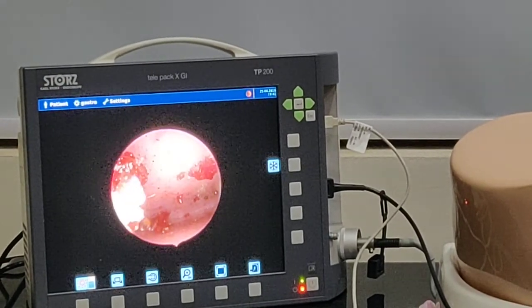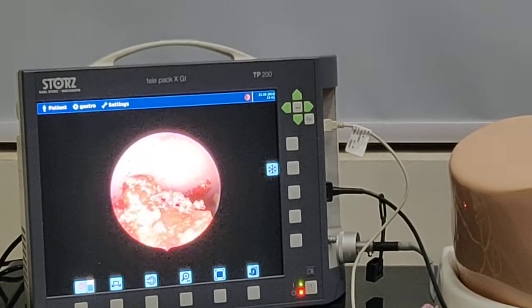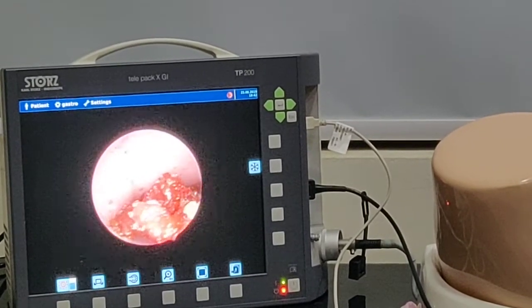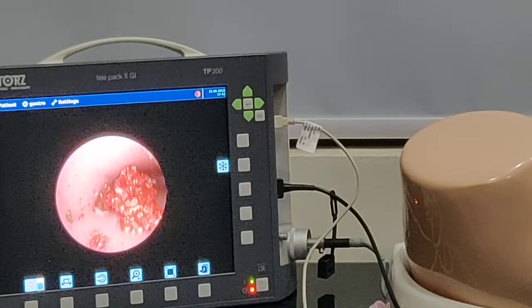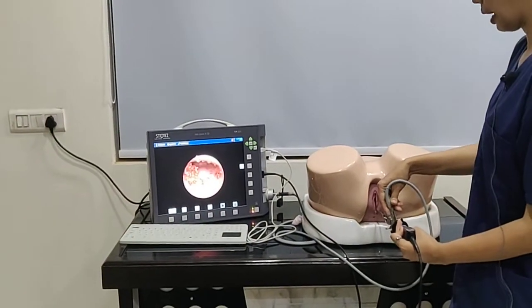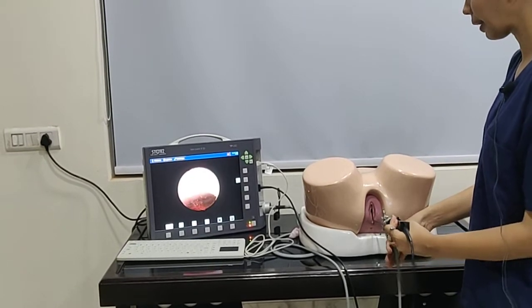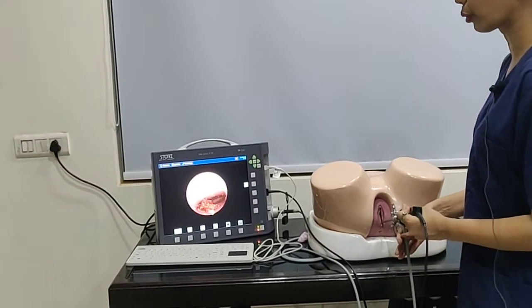We can also examine all four walls. At present we are examining the anterior wall, then the right wall, left wall, then the posterior wall — all this just with the movement of our light cable. Then we come back and again have a panoramic view.